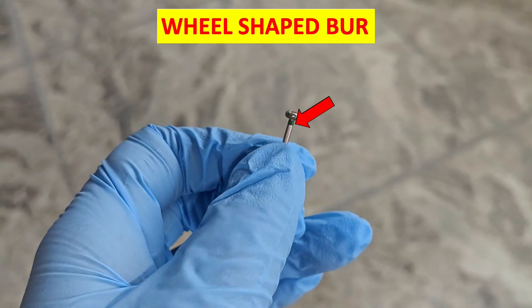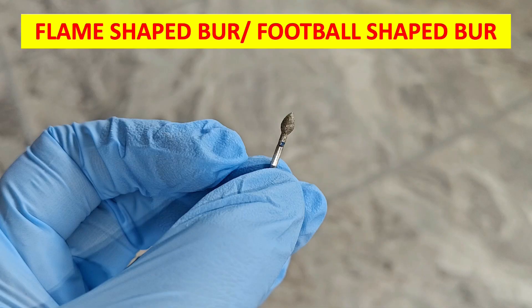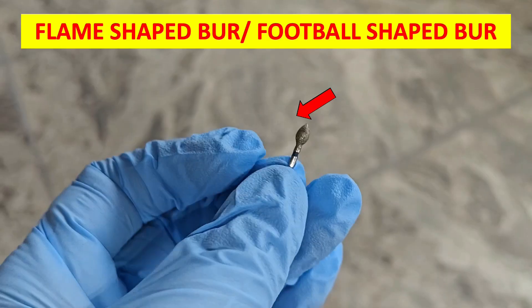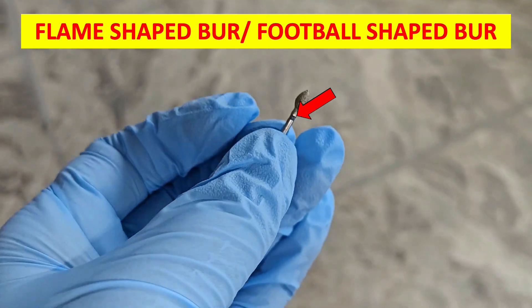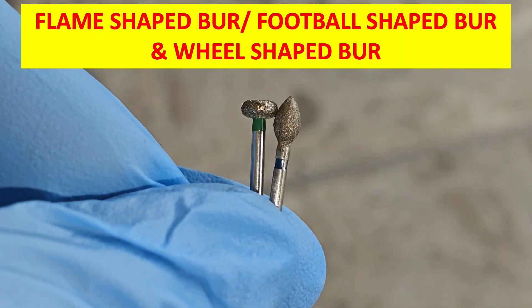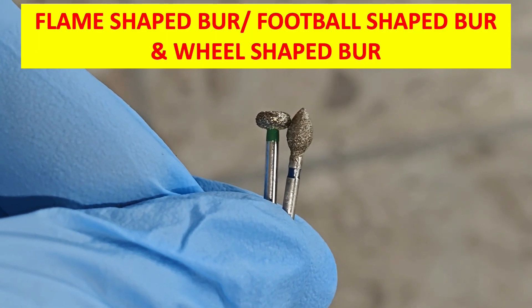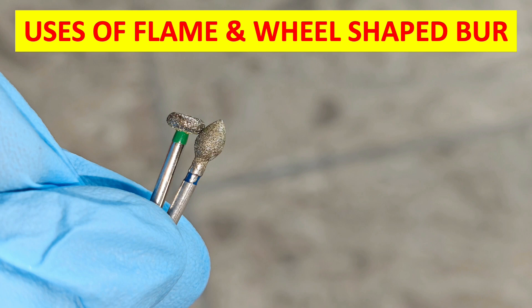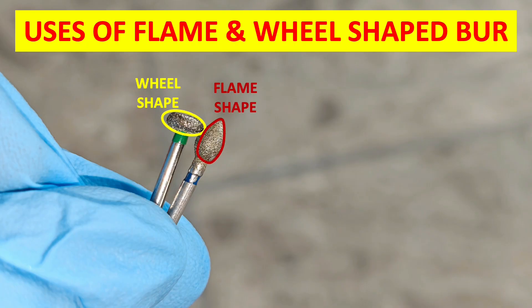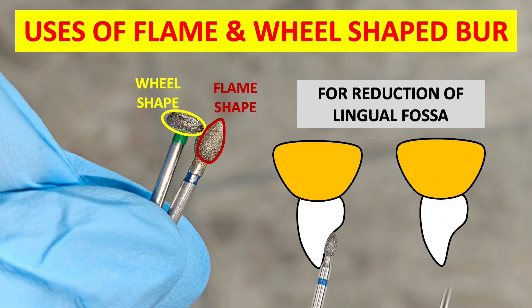The next bur used for tooth preparation is the wheel shaped bur. As you can see, the apex of the bur is wheel shaped, and that is why it is called the wheel shaped bur. Then we have the flame shaped or football shaped bur — the apex is flame or football shaped, which is why it is called that. The flame shaped bur and the wheel shaped bur both have almost the same function: they are especially used in the anterior region for canines and incisors for cingulum reduction. Both burs are used for the reduction of the lingual fossa.